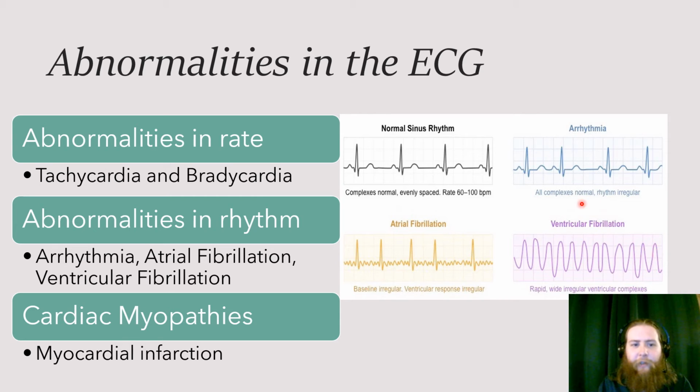And then in ventricular fibrillation, this is where we get these very wide, rapidly oscillating complexes, as the ventricles are beating as fast as they can and not giving anything else. There's no other electrical activity being recorded here, because once again, the ventricles have a much larger peak than the atria. So they have a much larger difference in charge, so they're hiding all those atrial instances in the heart.